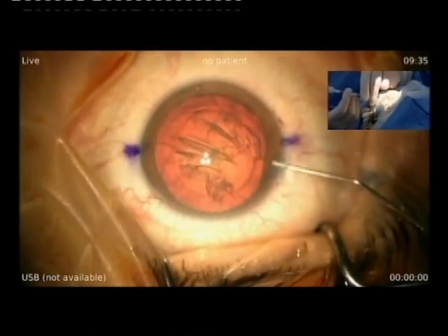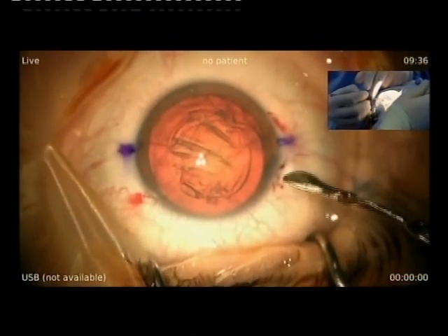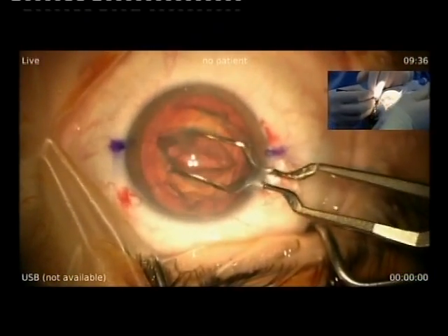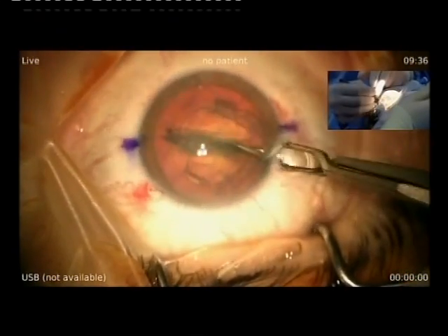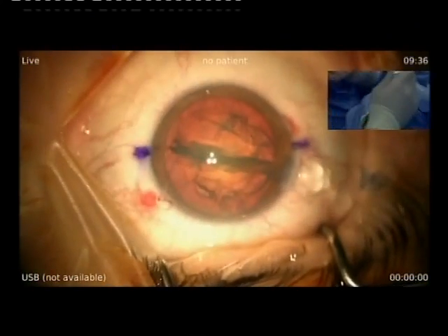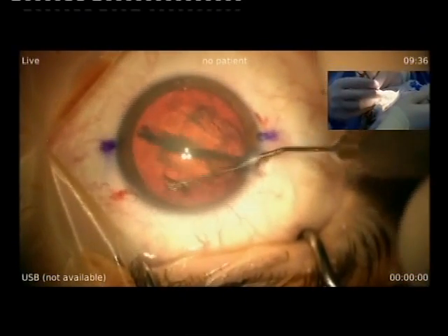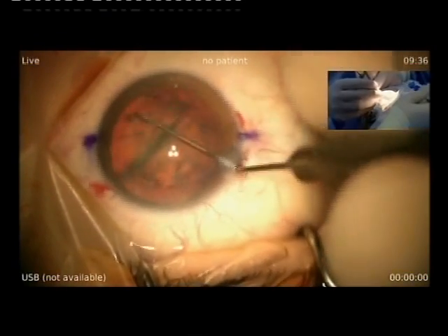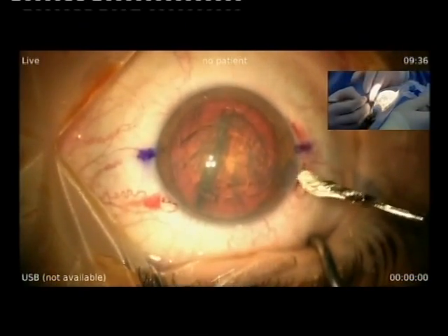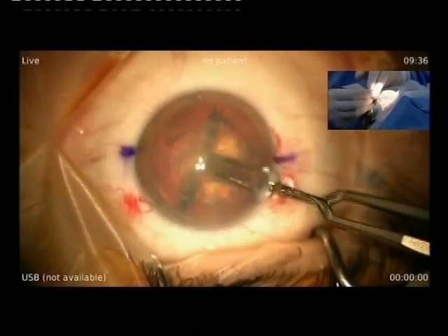This is a soft nucleus because the patient is only 59. So it will be very easy to cleave. With the Akahoshi pre-chop, I cut the nucleus. It's easy. This is my usual technique in 90% of my cases. For very hard cataracts, of course, it's not possible. But in a lot of cases it's very easy, and you don't have to use too much ultrasound — it's quite good for your endothelium.